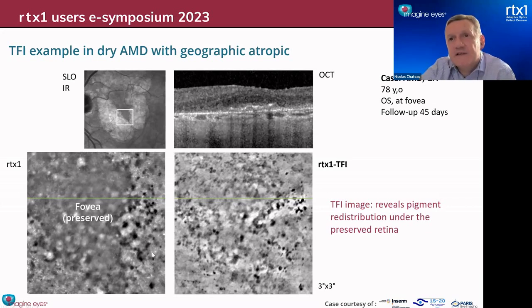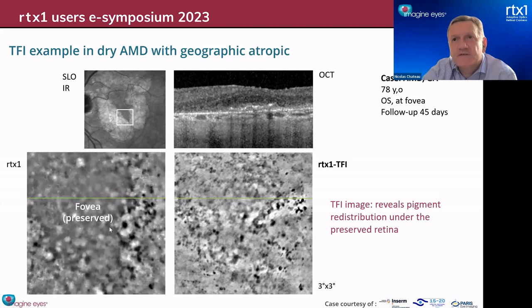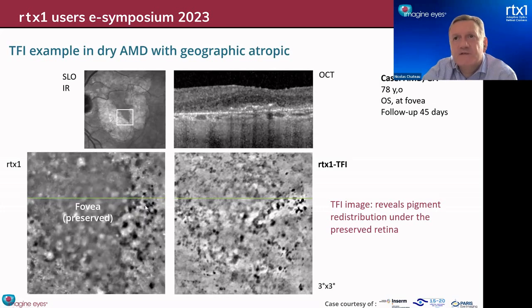And in the atrophic area, as Christopher Holmes has shown before, we see a number of clumps of pigments that are present. And yes, there is a follow-up. In the follow-up, we also can see some changes in the distribution of pigment. And you can also notice that these clumps of pigment are located in the atrophic area.